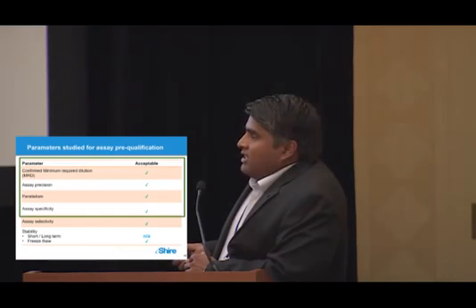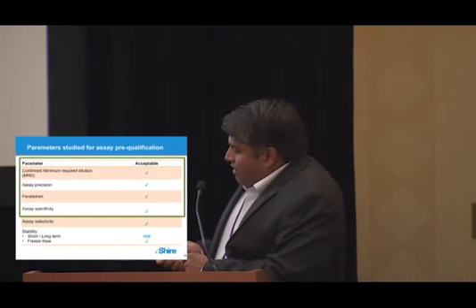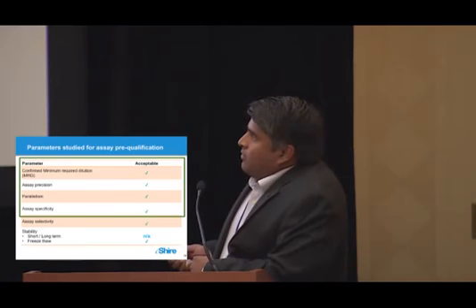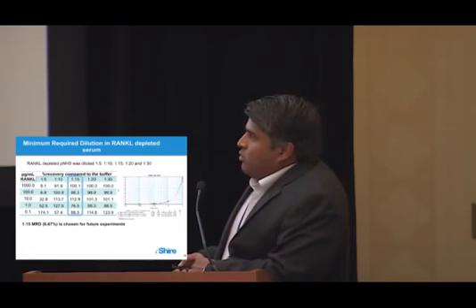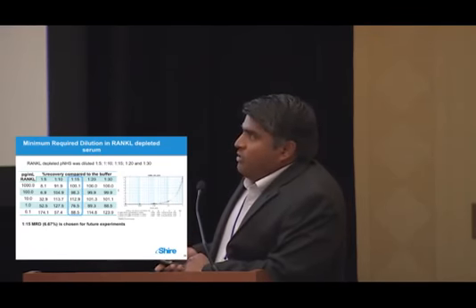When we spoke with the Quanterix scientists, they said typically anything below 0.02 AEB should be background. So we wanted to optimize this assay. We went ahead and did some additional assay optimizations. We selected various parameters that we can test, and we also compared homogeneous or sequential, where in homogeneous you mix your detector, capture antibody, and sample all together, or sequential, which is one after another. I also looked at calibration curves and fitting and weighting. We have other assays that we are developing right now on SIMOA, and we are using DOE for that to optimize these conditions to come up with a good calibration curve.